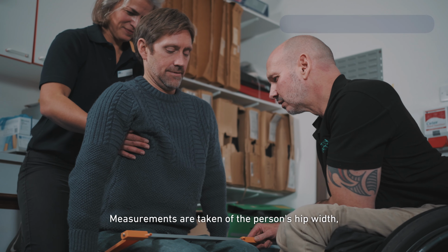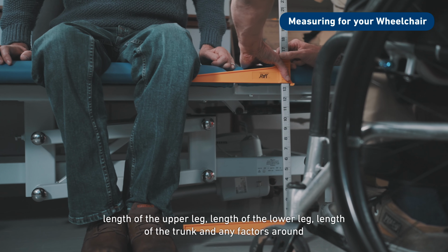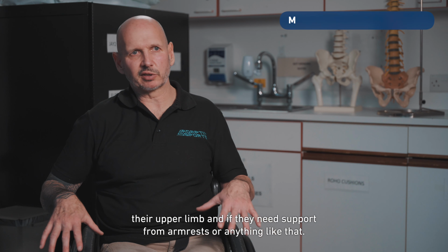Measurements are taken of the person's hip width, length of the upper leg, length of the lower leg, length of the trunk, and any factors around their upper limb and if they need support from armrests or anything like that.